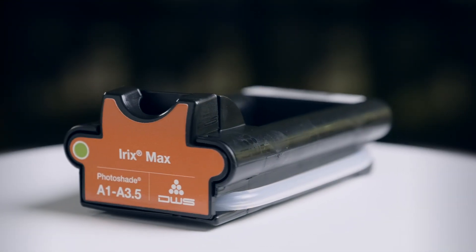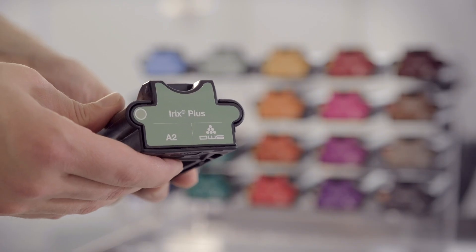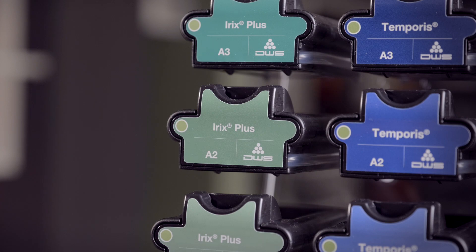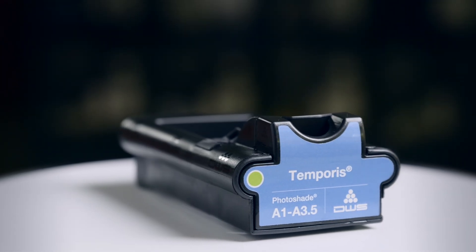Irix Max is the top-of-the-line hybrid ceramic for permanent restorations that offers ultimate performance and aesthetics. Irix Plus is the ultimate hybrid composite that combines high performance and cost efficiency in permanent restorations. Temporis is the ideal composite material for long-term temporary restorations.